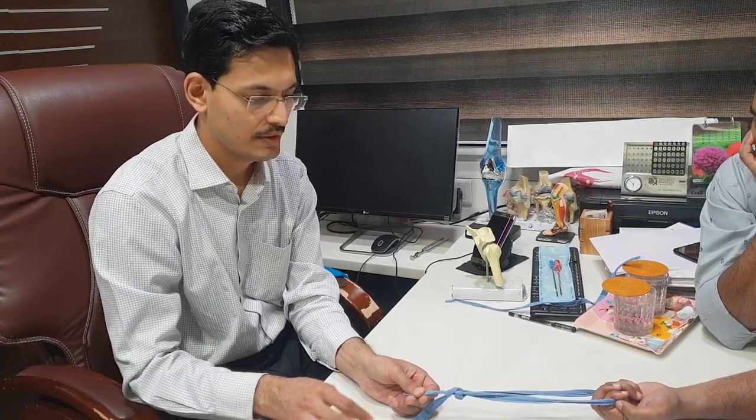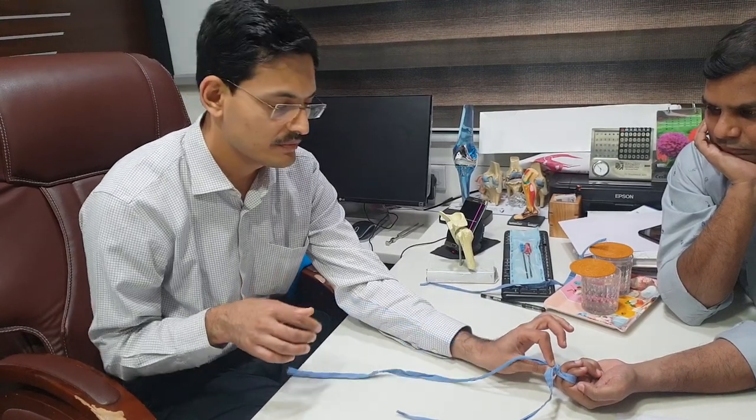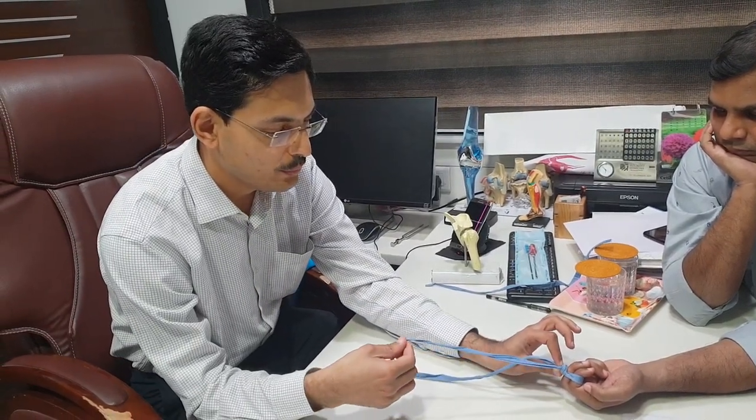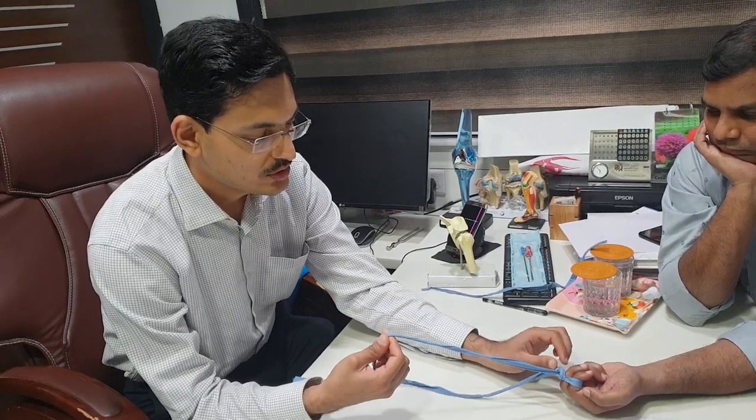When we pull it, this will be a sliding knot which will be just locking it into place. This is a sliding locking knot. When you are on your target and you have achieved full compression, then only you have to pull the other end.